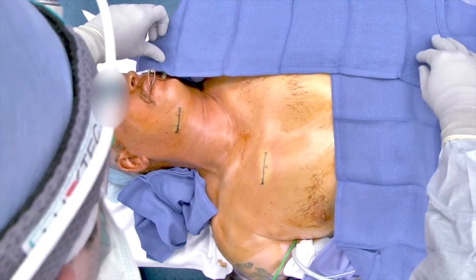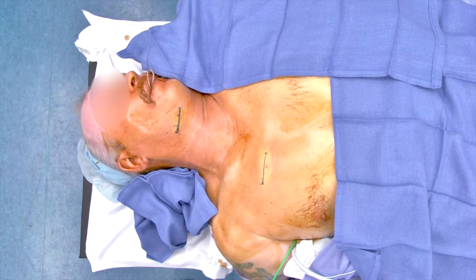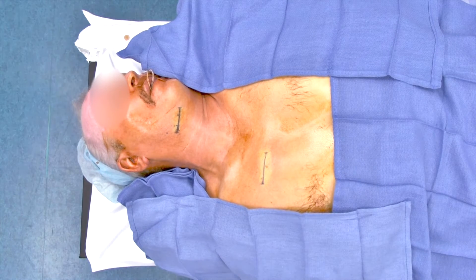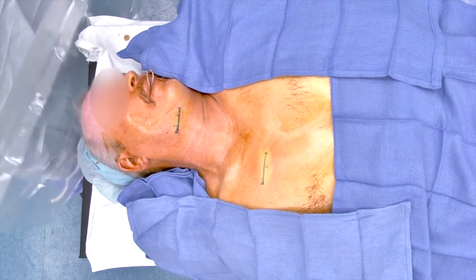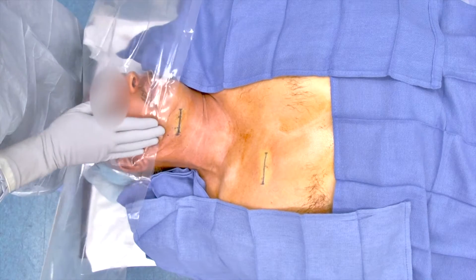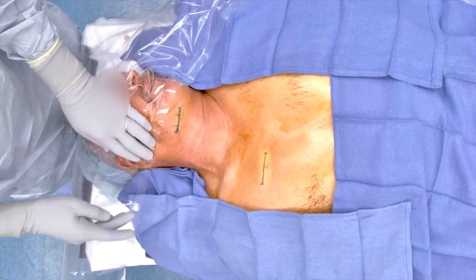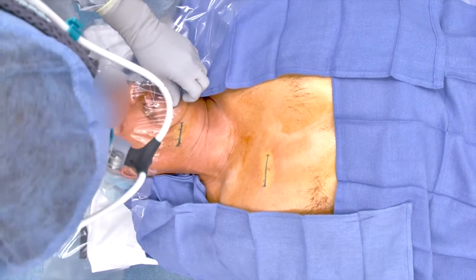What I'll typically do is place blue towels around the incision, as you can see here. I would also point out that initially I would use a bite block to open the mouth so we can see the tongue protrusion. I've gone away from this as I feel it does push the mandible down, limiting the dissection of the hypoglossal nerve. After the blue drapes are down, we'll place the clear drape over the patient's jawline, just superior to the incision, so that we can see the tongue protrude as we stimulate it.